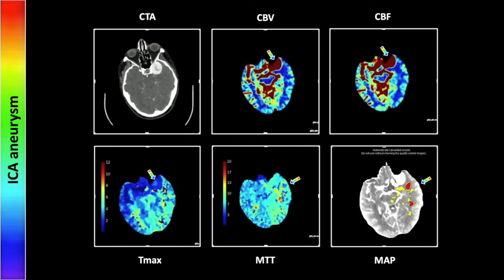Our next case is an internal carotid artery aneurysm at the carotid apex on the left. On the CTA, you can easily appreciate that swirling, somewhat delayed filling of a large, well-circumscribed mass in the region of the carotid apex. That is registering on the CBV and CBF as increased volume and flow. But on the Tmax and the MTT, we see relatively extensive asymmetry involving almost the entirety of the left hemisphere, with a depressed Tmax in the aneurysm region and an increased Tmax and mean transit time in the rest of the left hemisphere, consistent with ischemia.